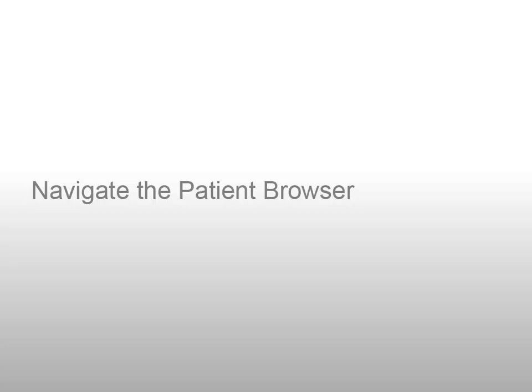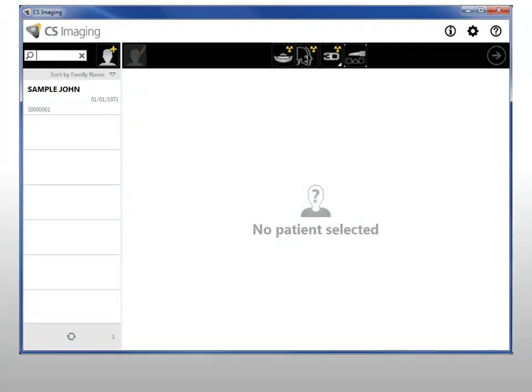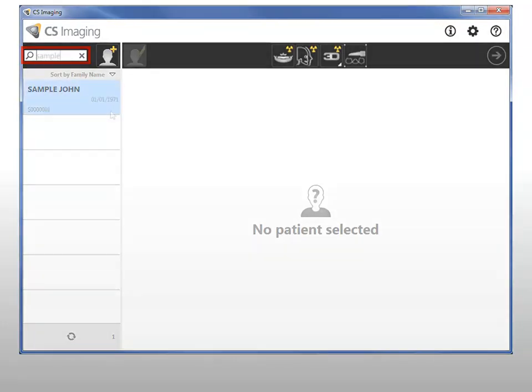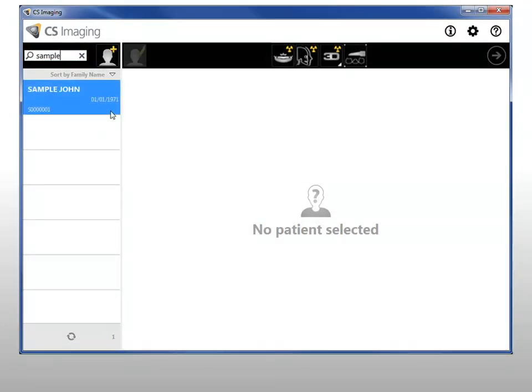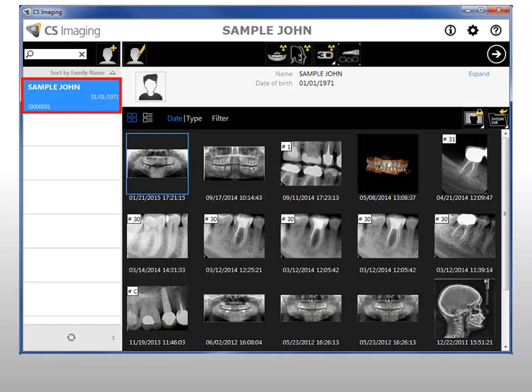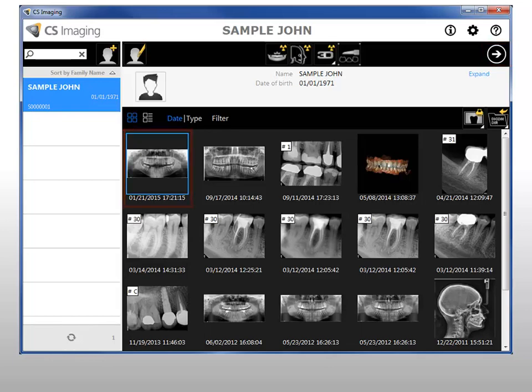Navigate the patient browser. When the patient browser opens, search the patient name here, or click to select a name from the patient list. To launch CS Imaging, you can use the Launch CS Imaging button or double-click an image thumbnail in the patient history.